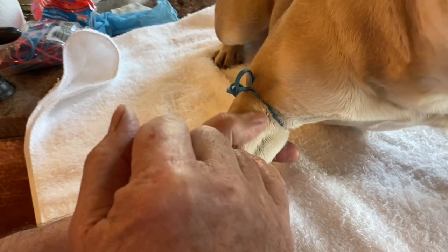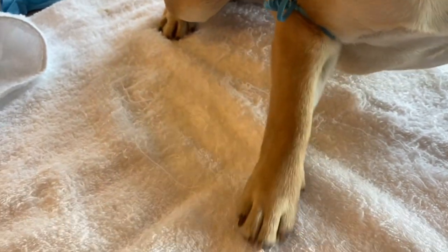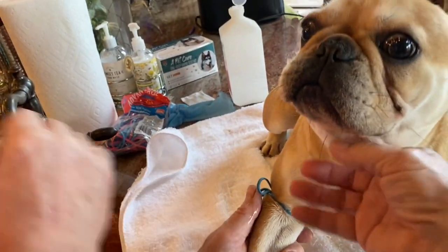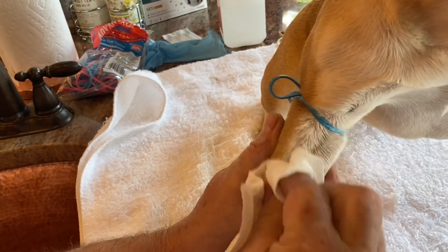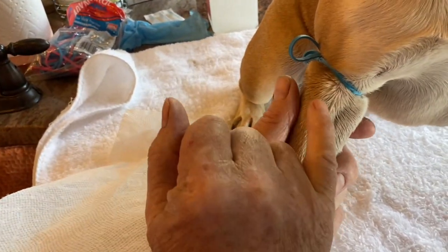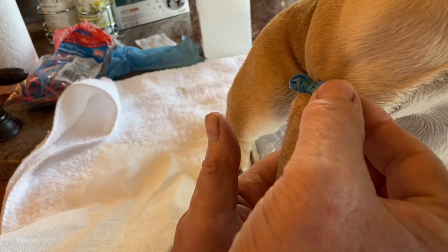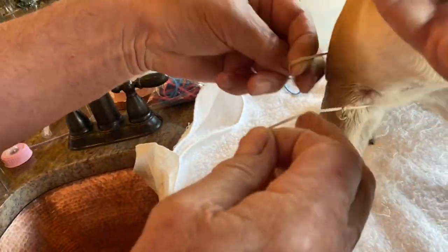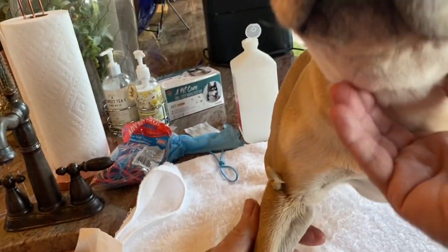And now you can see the veins popped up right there. If you shave this and put some alcohol on it — by the way, if you're going to do this, you need to have gloves on, keep everything sterile. Hard for you to see it, but I can feel the vein right there. The alcohol does two things: one, it sterilizes the area. Take a paper towel and get everything nice and wiped off with the alcohol. Put a bit more alcohol on it — it makes the skin cold and draws the skin up. And I can absolutely feel the vein right there. The smaller band goes around the arm, pull it through, get it where you want it, and just let it go. I can see the vein right there just popping up, and a single pull gets it off.